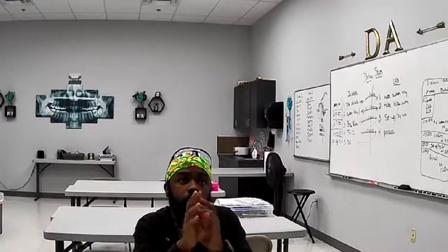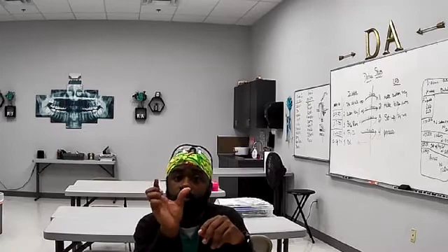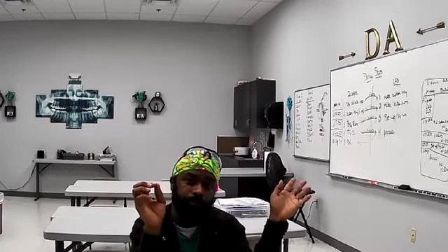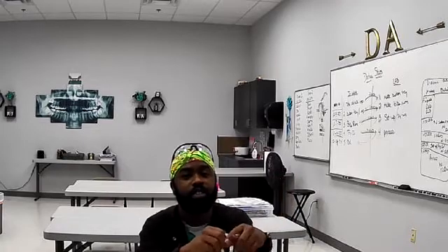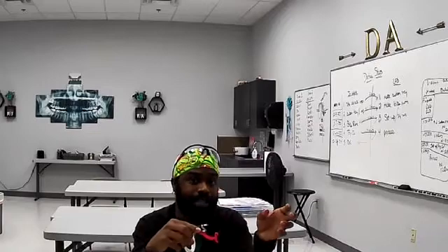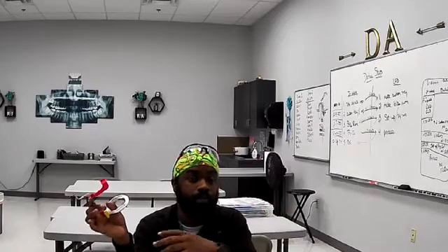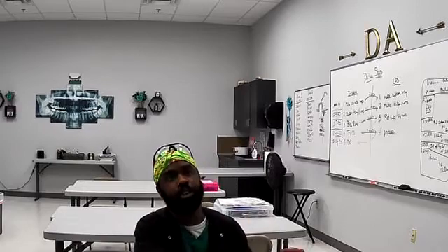I will show y'all more on the traditional X-rays, the little ones that I showed y'all on the light yesterday. It's a completely different way of developing those pictures. You have to take the X-ray, go into the dark room, develop them, and then come back out with them. I'll also show y'all that one day.